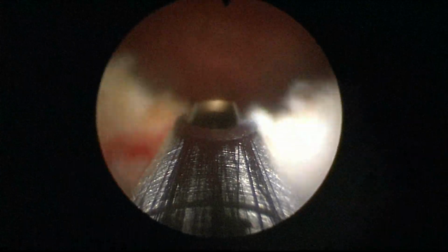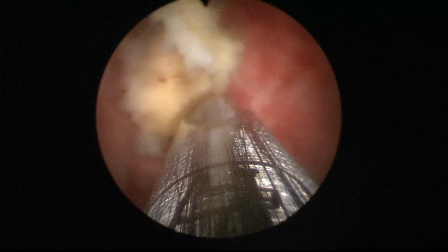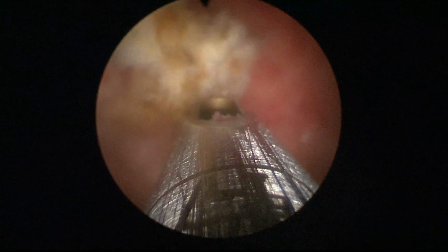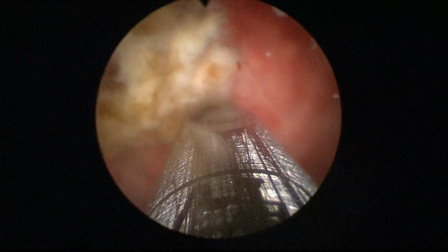And we were lucky this time. As I said, if the tissue is very, very hard, often I just resect it at the end. But that's almost the conclusion. Sometimes the blades can get obstructed with the tissue, and I don't know if in this case it happened. You see there's no suction on the tip because there's some tissue blocking, so we had to review it, I think. And yeah, morsellation is like that. Sometimes it makes you stop, and sometimes you have to look for alternative plans.